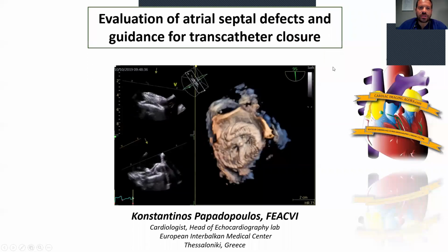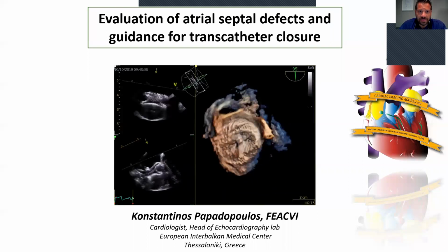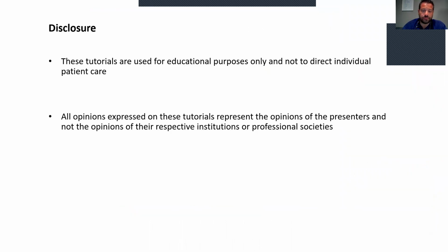Hello, this is Konstantinos Papadopoulos from Greece, and in this tutorial we are going to talk about how to evaluate atrial septal defects and how to guide the interventionist for transcatheter closure.